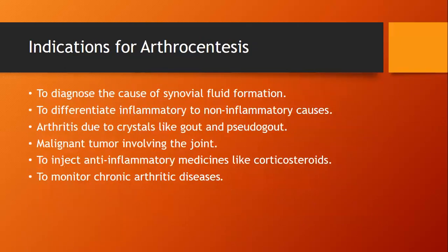Now, these are the indications for arthrocentesis or collecting synovial fluid. Okay? To diagnose the cause of synovial fluid formation, by this phrase we mean increased synovial fluid formation. Okay? To differentiate inflammatory from non-inflammatory causes of synovial fluid accumulation, and to see if the arthritis is caused by crystals like gout or pseudo-gout.